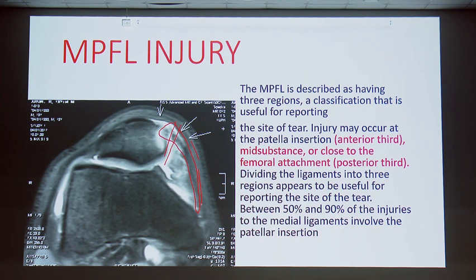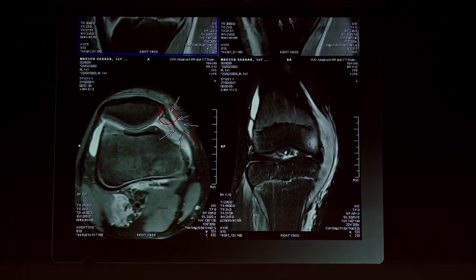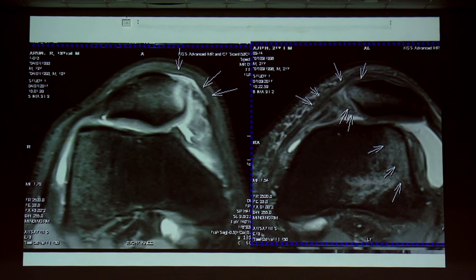These are the things we should report, because whenever we are seeing this medial patellar facet injury, we should always look carefully at what is happening over the adjacent MPFL. That is very much essential. You can see the MPFL injury, particularly on this side, and this is absolutely normal along the central as well as femoral attachment site. You can see a near complete full thickness tear, almost close to here. And you can see the central portion is injured over here.